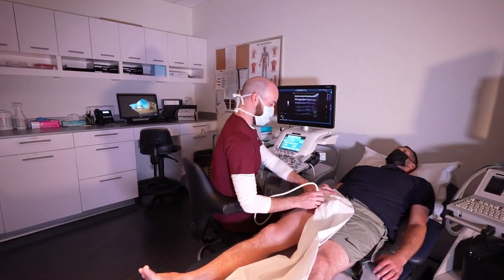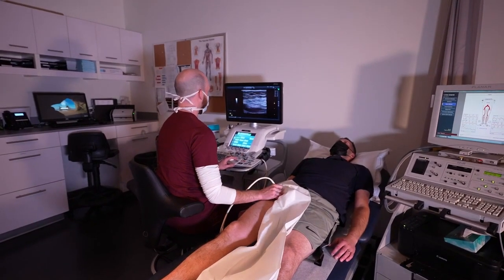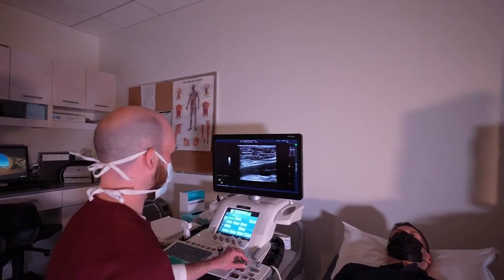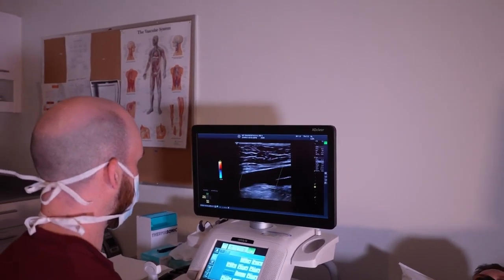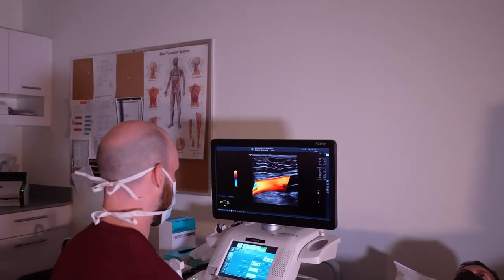And for a leg arterial ultrasound scan, we start at the groin for each patient, and then we basically follow the leg down to the ankle. We're going to be applying some jelly, and we're going to be taking pictures at multiple levels, basically to ensure that we're imaging all of the blood vessels as we need to, and making the most appropriate diagnosis.